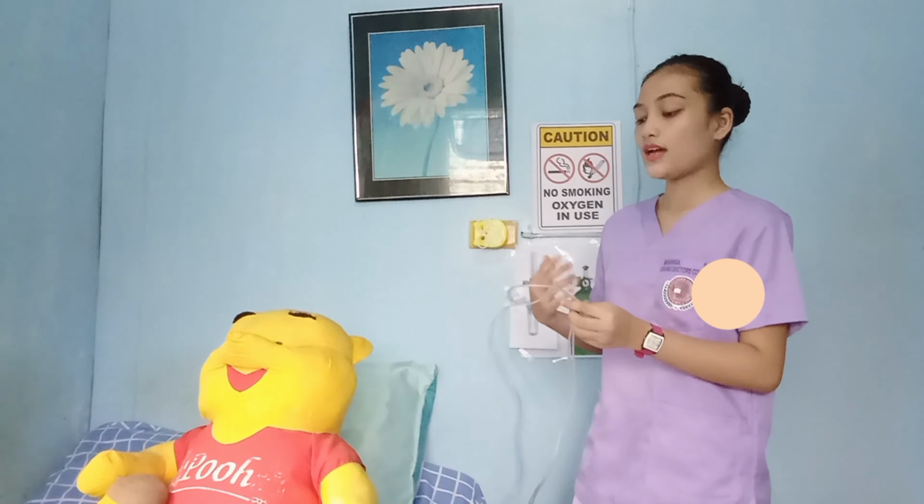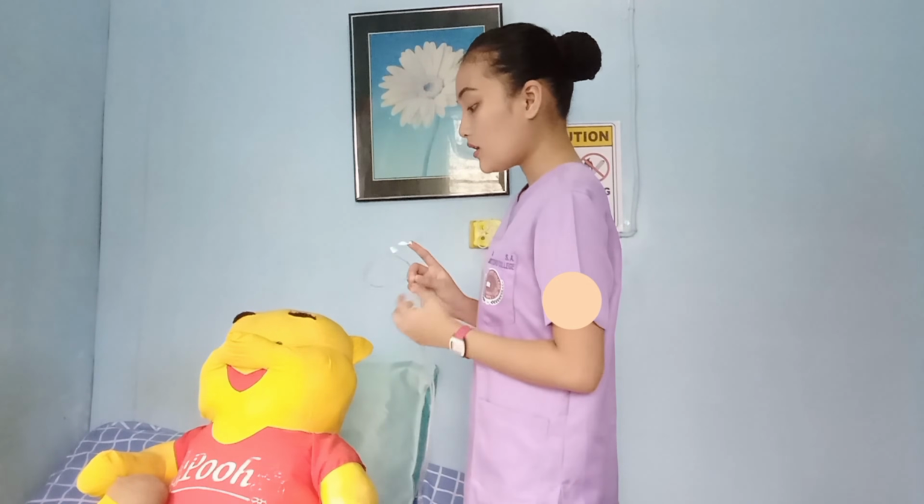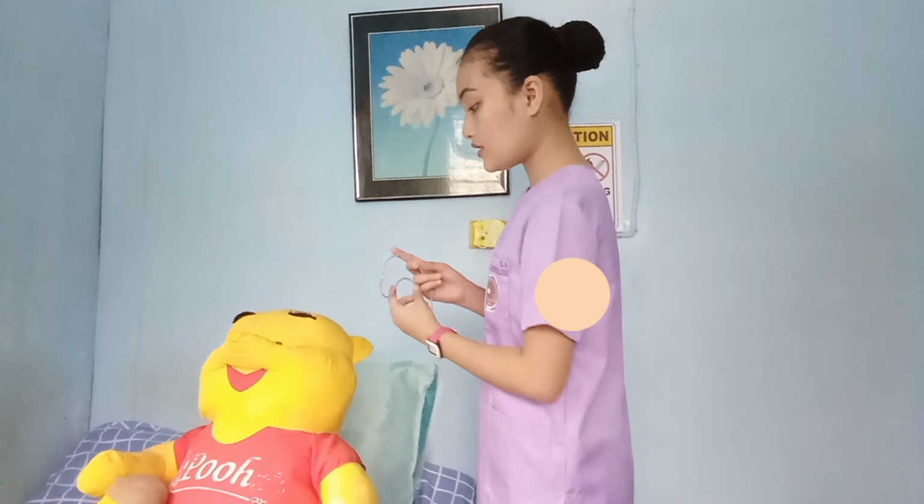So as you can observe, our cannula outlets have a slight curve in them, so this should be placed into the nares like this. Proper fitting of the cannula into the nares will ensure correct and accurate administration of oxygen. Okay, sir, I am now going to place this cannula into your nostrils.